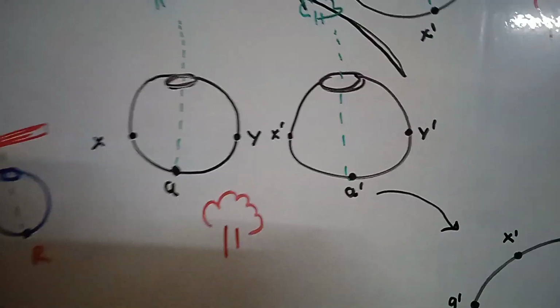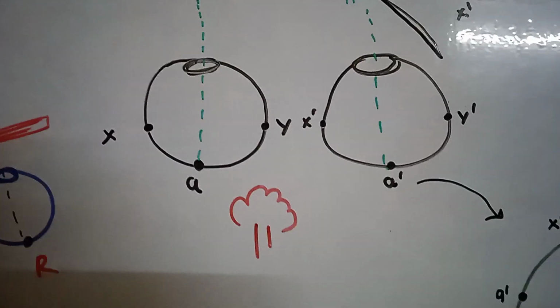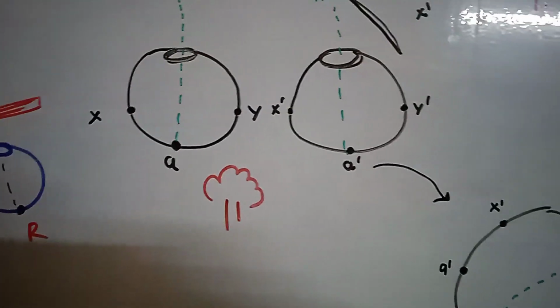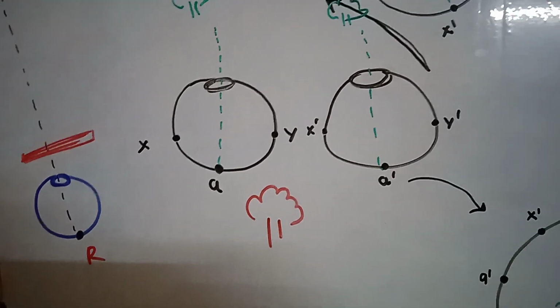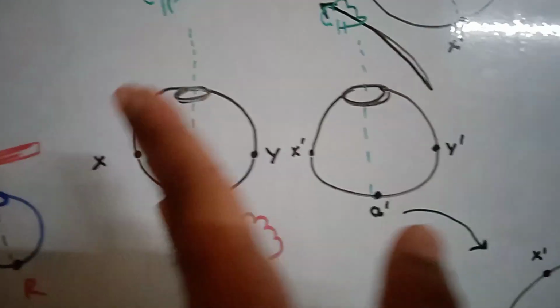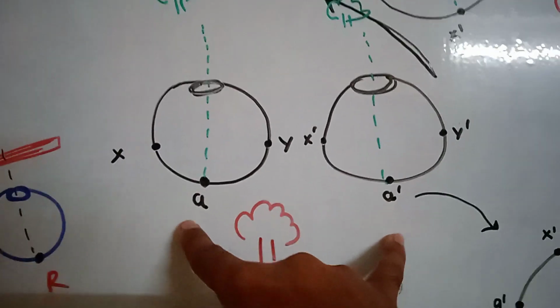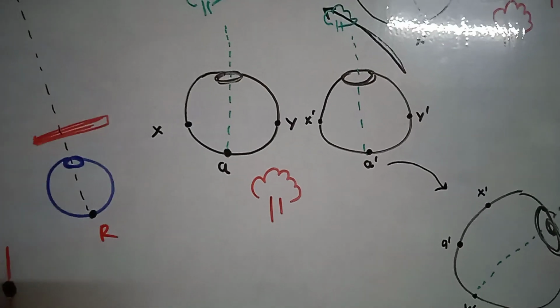Now look at this. So this is supposed to be how a normal eye is, and now I will introduce you to the concept of similar points, and this will help you whenever you forget where the rod goes in esophoria and where the rod goes in exophoria. All you have to do is mark 3 points on the retina, name the center A, to the left is X and to the right is Y. Now the concept is whenever a light falls on the same points of the retina, that is A and A dash or X and X dash, you will not see things as two.